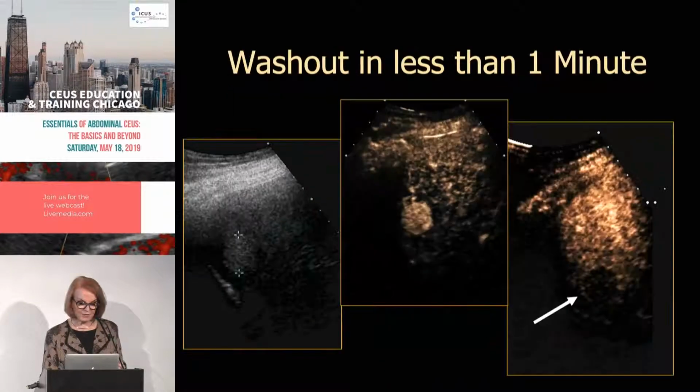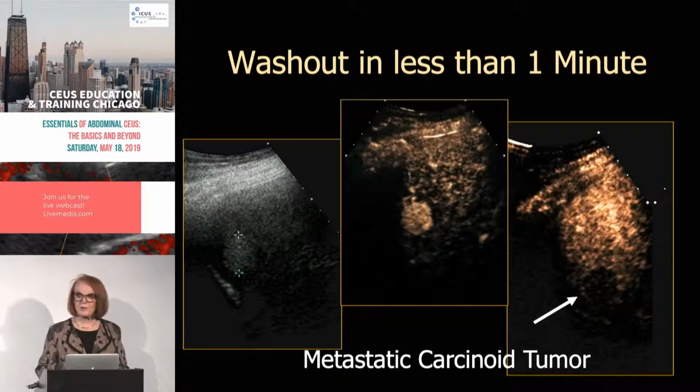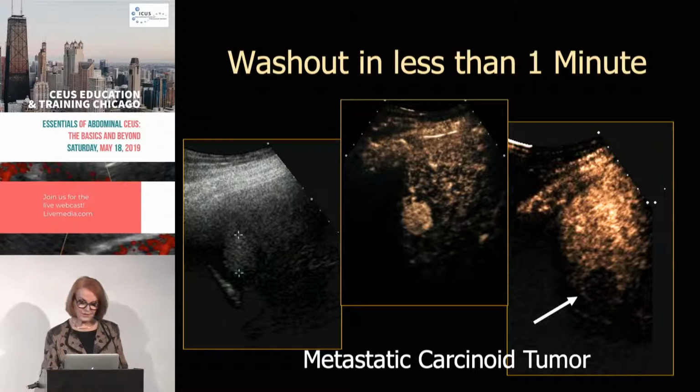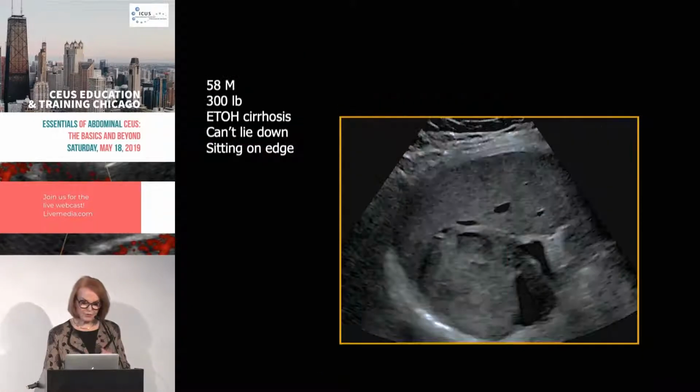So this lady did have the biopsy, and she has a metastatic carcinoid tumor. And so this is a totally unsuspected, unknown tumor. And so this is a very valuable ultrasound lesson.